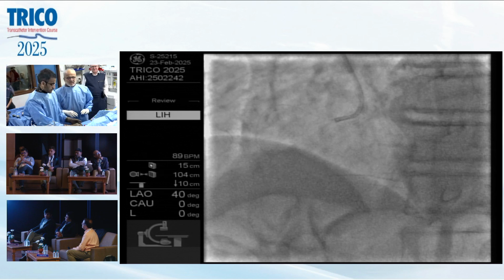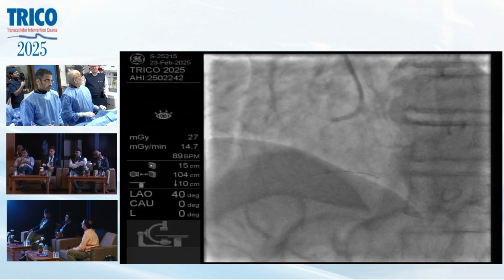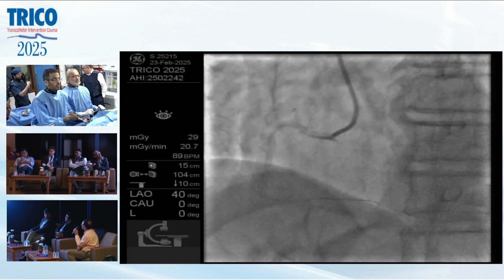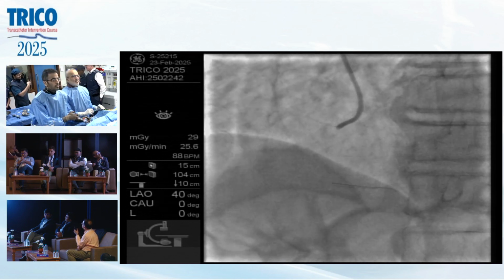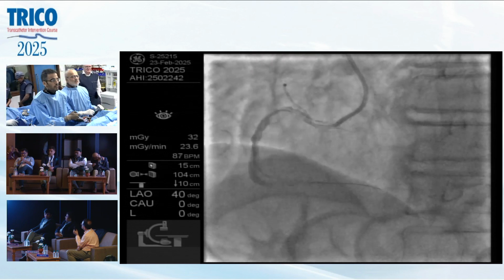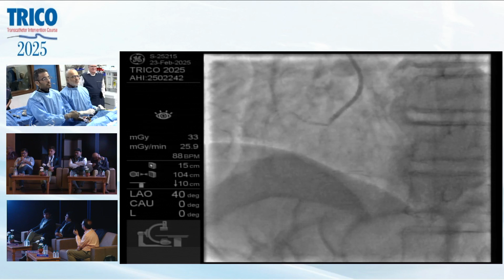This is what it is now. Now what I will do is inject. So you're going to walk the guide back. A little bit back and clockwise rotation. A little back and clockwise rotation. A little back. Still a little back. And here, scout.